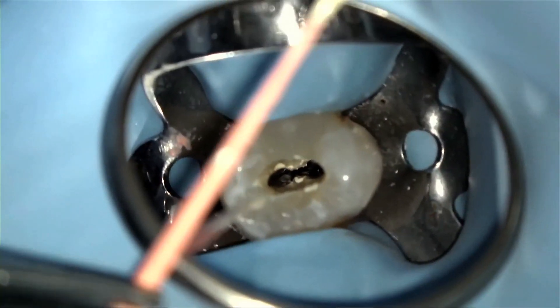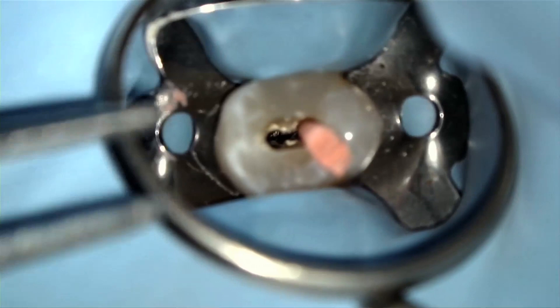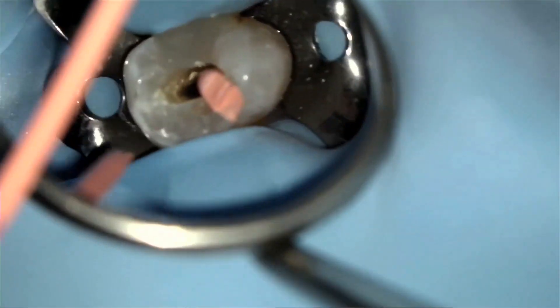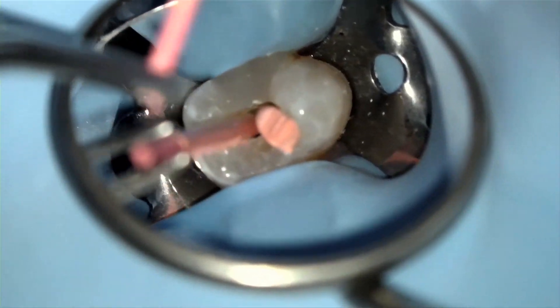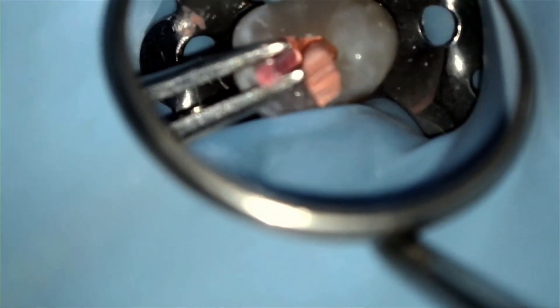First, I'll speak about obturation of ovoid canals. As shown in the video, in ovoid or large canals, I personally like to place a single master gutta percha point corresponding to your master file at one side of the canal, leaving space for the gutta core that will be inserted alongside it. To improve visibility and reduce interference with the warm gutta core, I suggest cutting the cold gutta percha at or below the occlusal table. This is the same as I recommended doing with paper points meant to block out adjacent canals.